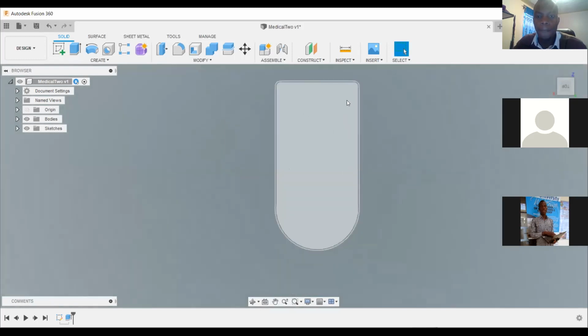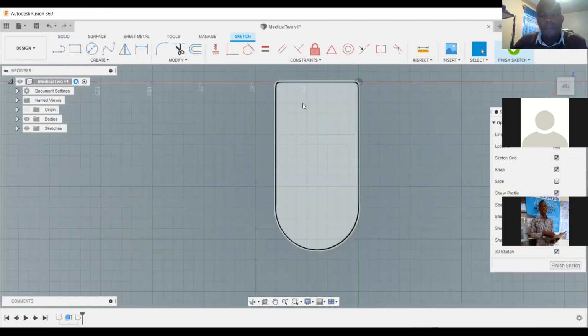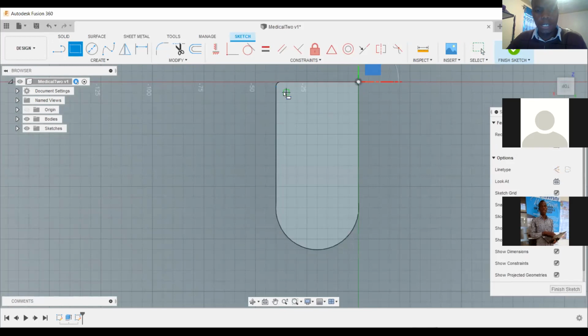So we want to create a screen here. For example, guys, you've seen this Kenya Power device. It has a screen here where you will see the writings and all that. Okay, guys. So we want to create a screen there. So it's very easy. Come and click sketch. We are building something like this medical device. You can measure your blood pressure. If you go to hospital, they put some wristband, and then there is a tiny device with a screen where you can see that. So we are just building such.